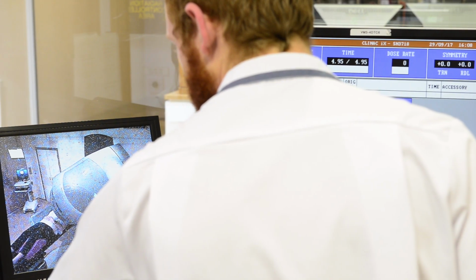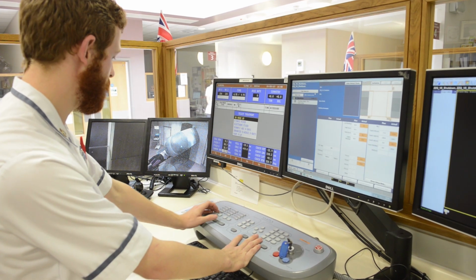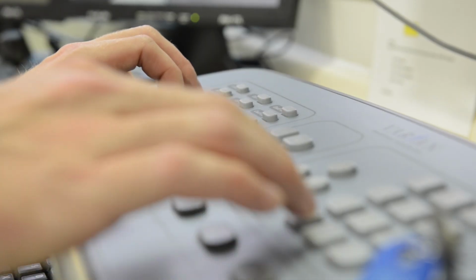We are giving you a treatment using deep inspiration breath hold. While we are setting you up in the correct position, we will have times where we ask you to take a deep breath and hold that. We need to try to get you to treat the same amount of breath each time. We will speak to you over an intercom, and this will tell you when to take a breath in and when to release.